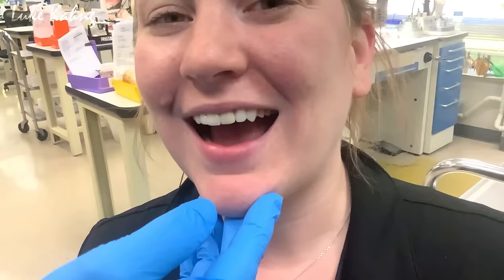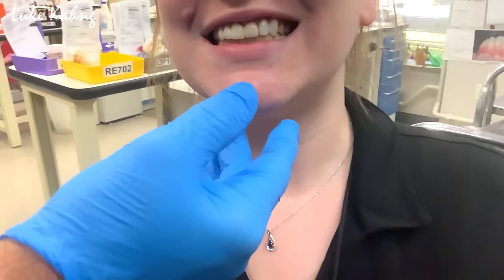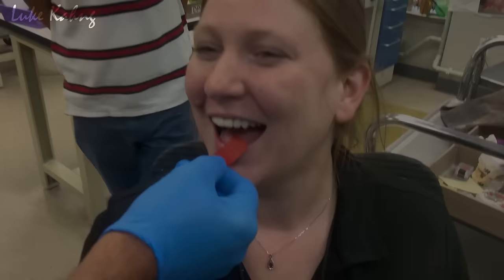Very nice. Wow. Do you feel the bite okay? You're not hitting it? A little bit on the back. I'm just kidding, right? Bite down a couple times. Go ahead. Okay. Open. Go ahead and remove it.